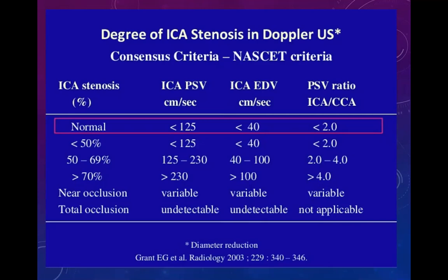So is there any role of plaque measurement and diameter reduction in the 2D image? Is there any role of measuring the stenosis? There is a role, but hemodynamic measurement is a critical one, when you're treating the patients clinically, depending on their condition. Hemodynamic status is a critical one.